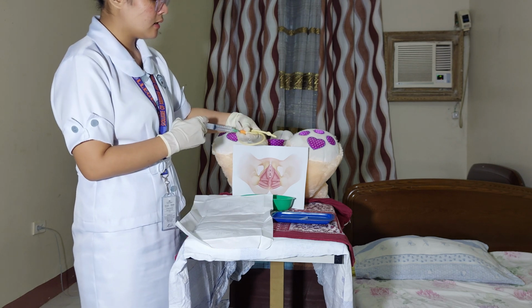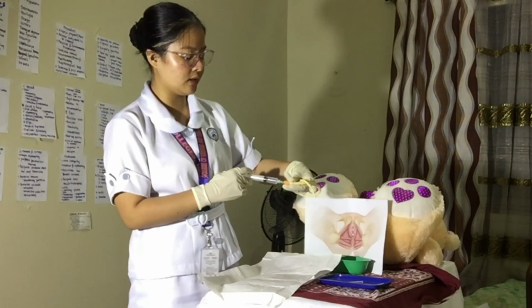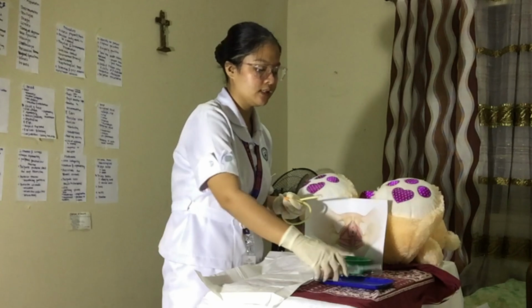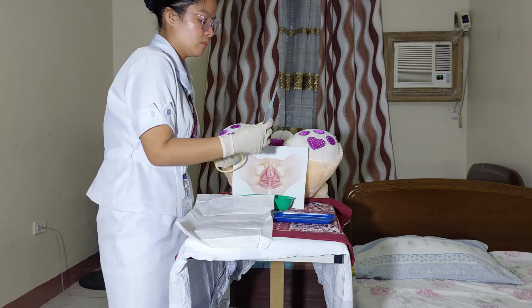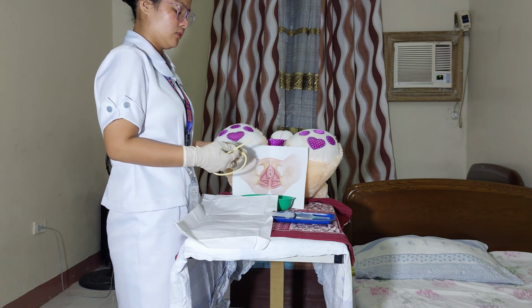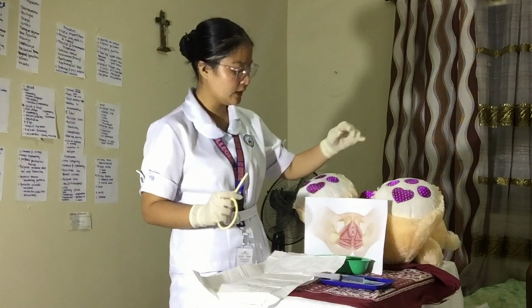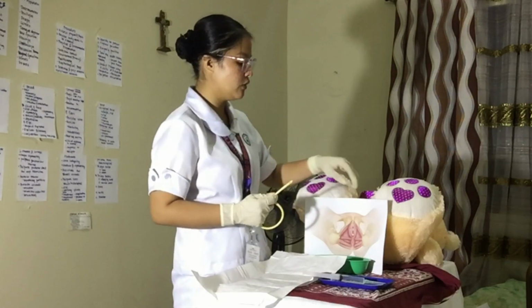So as you can see, gumagana naman siya. So dahan-dahan lang yung aking pag-plunge doon sa syringe para hindi pumutok yung catheter. So before inserting is I'm going to put some lubricant doon sa dulo ng aking urinary catheter. So now pwede na tayong magpasok sa ng patient. So pwede na natin ipasok yung catheter kay patient sa urethra ng patient.